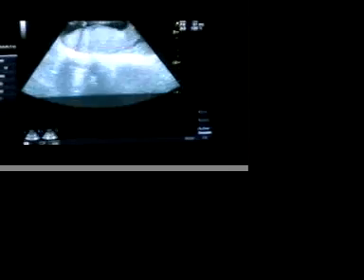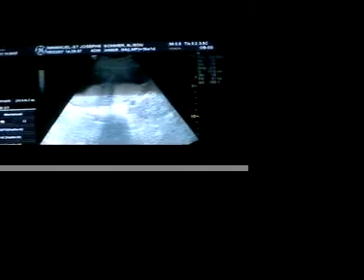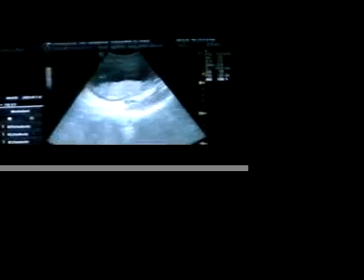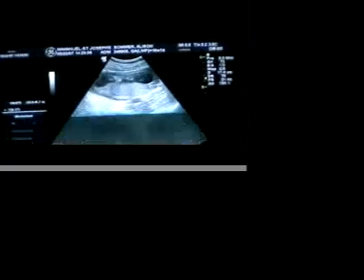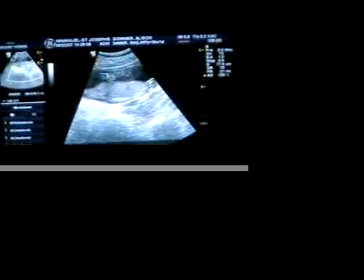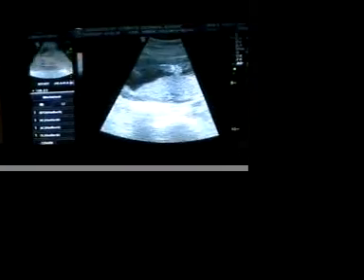Let's have a look at your feet. Sometimes the feet are awful cute at this stage of the game. And the bottom of the legs right there. So let's see if we can get those feet. Oh, honey. There's the toes sneaking in there. Let's get the whole feet. Let's zoom up here. Pretty similar to the hands, like those paws, don't they? Let's see how big that foot is.